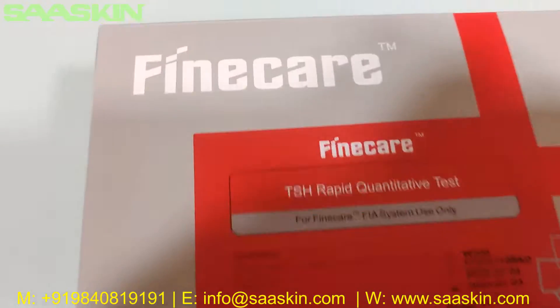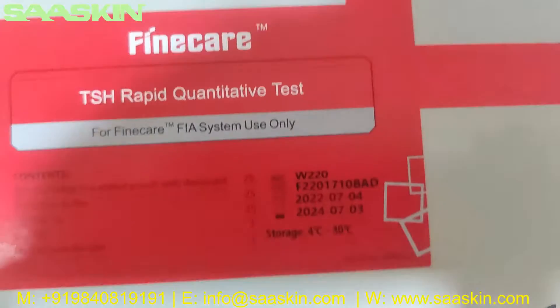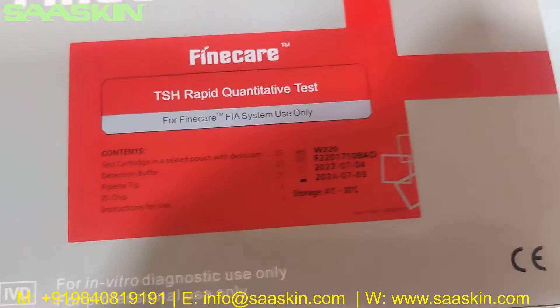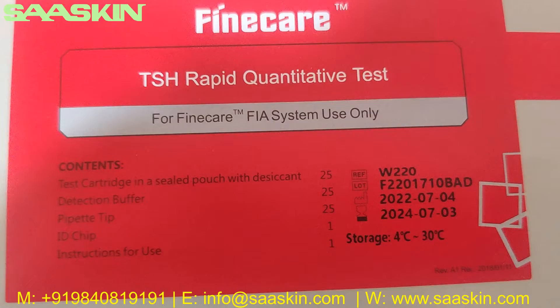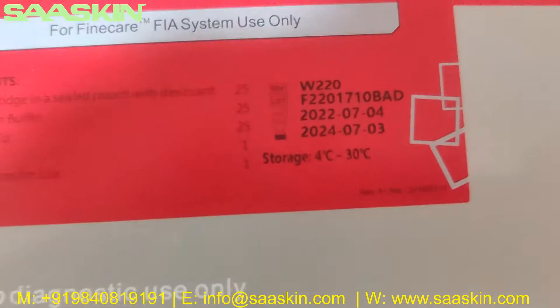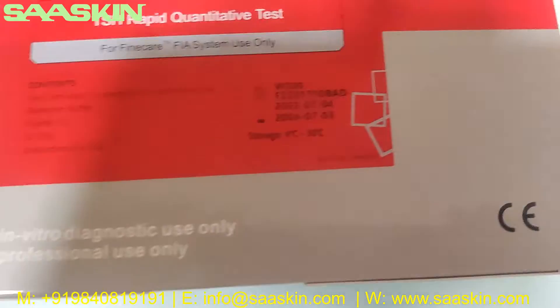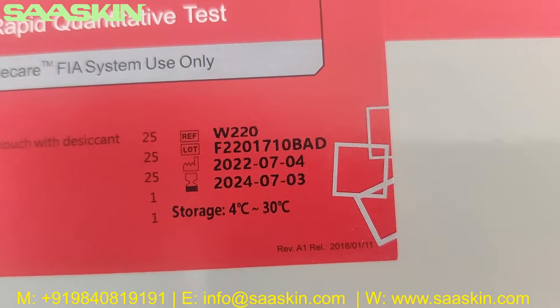Hello everybody, today we're going to see the unboxing of the Finecare TSH Rapid Quantitative Test. This is a 25-test kit box, and it can be used along with the Finecare meter system only. It's a CE IVD certified product, and you can see the reference part number and the lot number on the box.